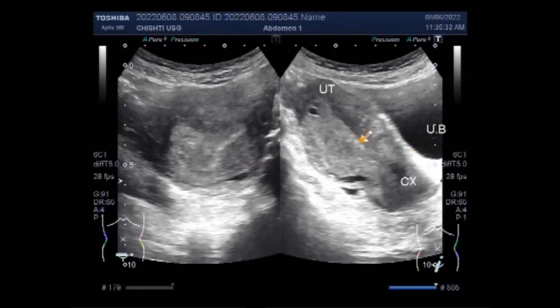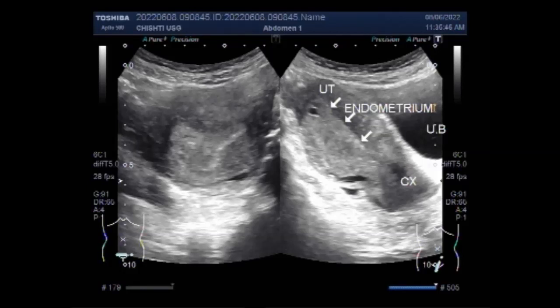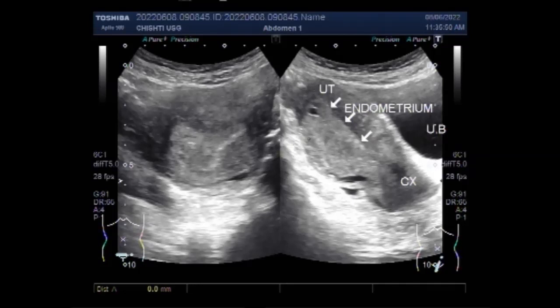The thickness of the endometrial lining is rarely over 4 mm in a woman past menopause. In premenopausal women, the thickness varies with the phase of the menstrual cycle, but the maximum thickness will be less than about 16 mm even in the secretory phase. Here, in this case, it is about 20 mm.